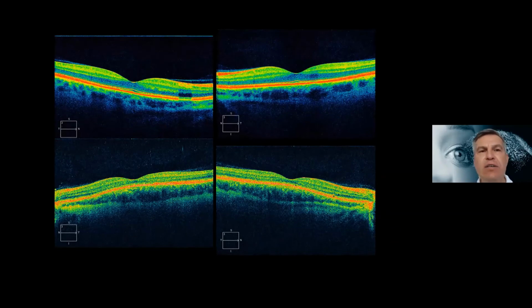The outer lines of the retina are also visible. In the first look from the lower images, you think, well, that's a normal eye as well, but it's not. The lower image is his son, and he had only a visual acuity of about 30%. He has learned in the recent years to live with that, but he has a severe disease of the eye.